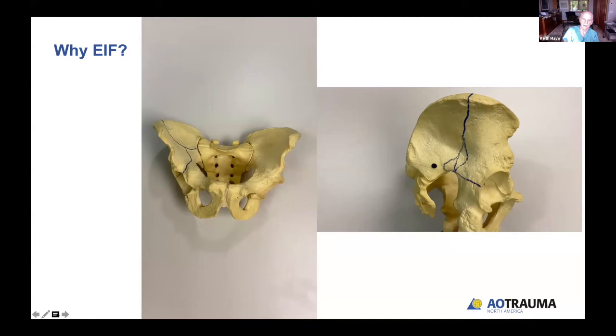So it's much better for the unstable inferior part of the sacroiliac joint, or a portion of the greater sciatic notch, which extends up into the inferior portion of the joint that you can't see. In a situation like this, I always wondered, with these relatively simple articular patterns in both columns, why we can't approach it like we would approach a plateau. And that is, we basically put the joint together first and then reattach that to the metaphysis or diaphysis.